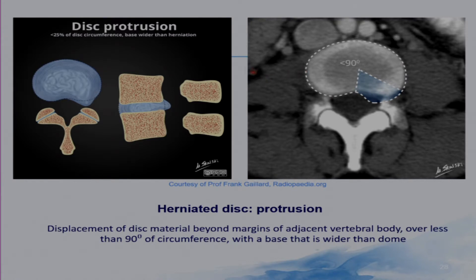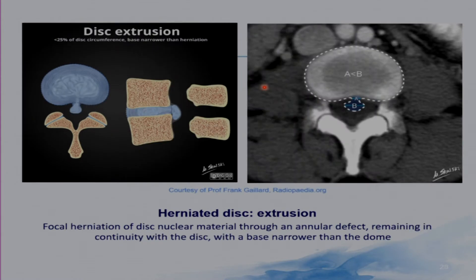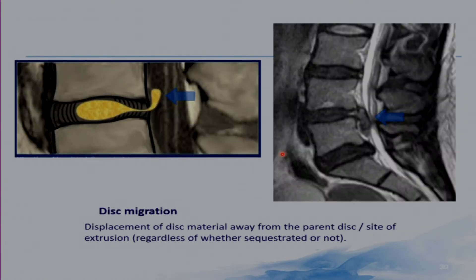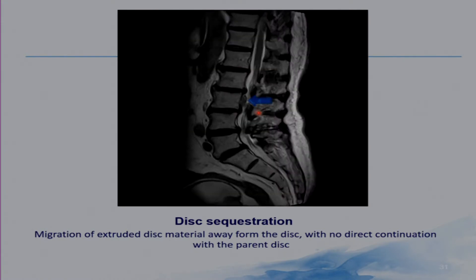A disc protrusion involves less than 25% of the disc circumference — that is, less than 90 degrees — and will have a broader base and a narrower dome. Disc extrusion, on the other hand, will have a wider dome and a narrower base. That is an example of a disc extrusion. Disc migration is displacement of disc material away from the parent disc. In disc sequestration, the migrated disc loses its direct continuation with the parent disc — essentially a free disc fragment, as seen on this MRI study.